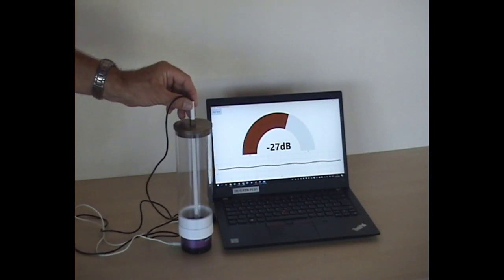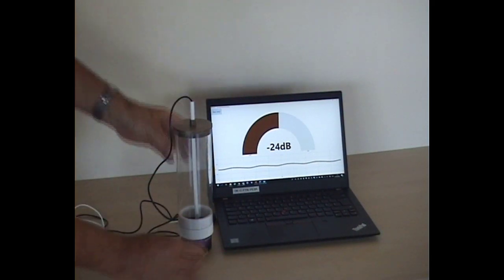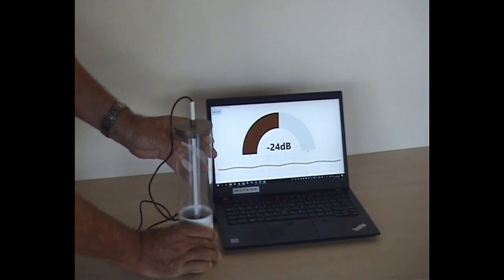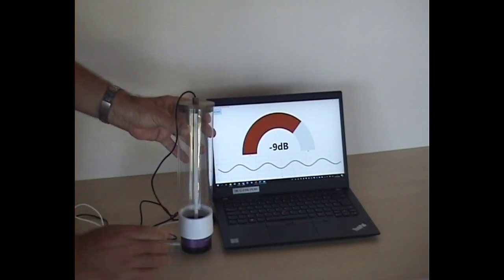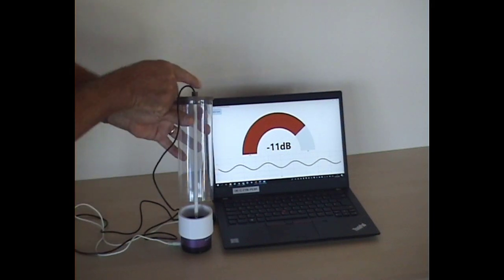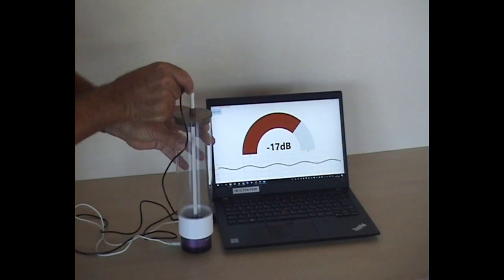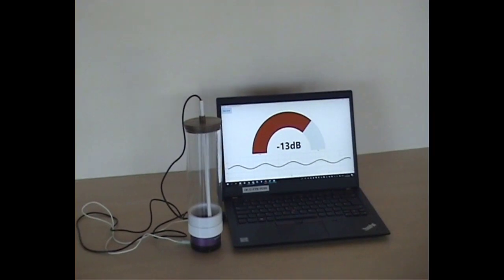And the reason for that is because the sound wave has reflected off the tympanic membrane and has been cancelled out. And we'll come on to that in more detail. But just as a little reminder, you can see that if I take the probe out of the ear canal, the microphone clearly shows that the loudspeaker is still producing the sound when it's not in the ear canal. But when we pop it in the ear canal and the tympanic membrane is in place, I'm afraid the sound field at the probe is considerably diminished.